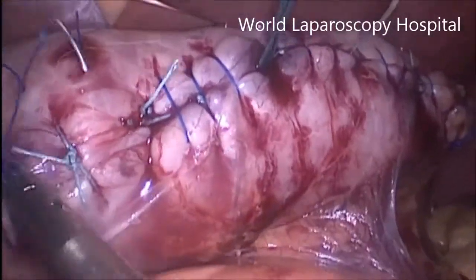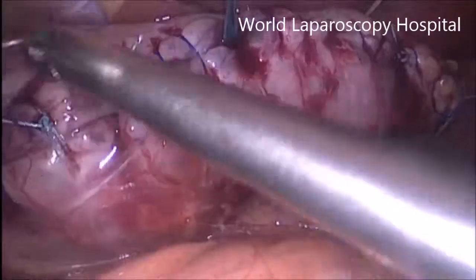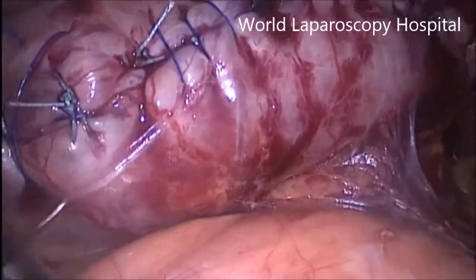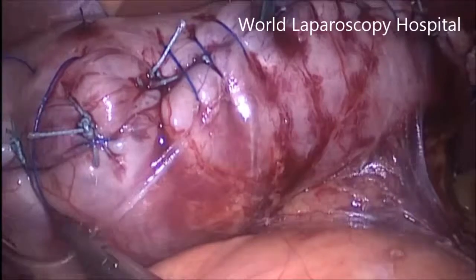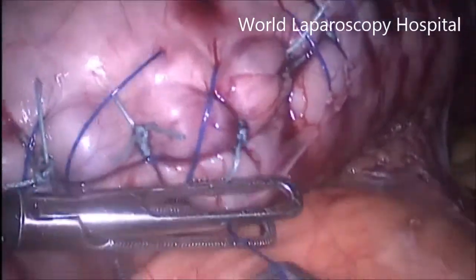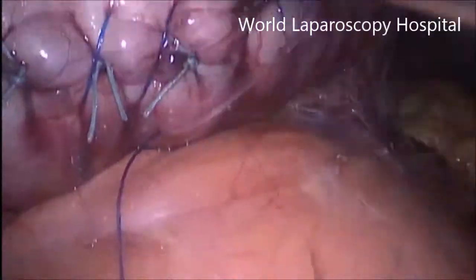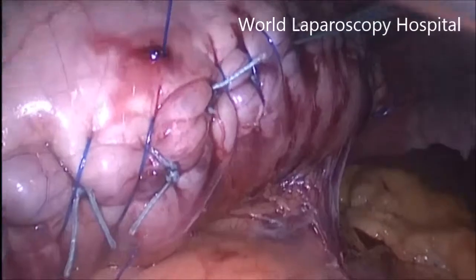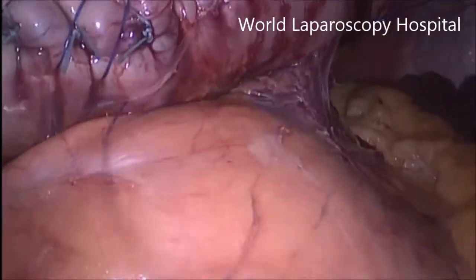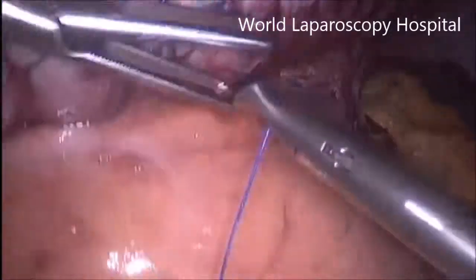At the end of the procedure, you have to make sure there is a 36 French orogastric tube towards the lesser curvature, and ideally that orogastric tube should come up to the duodenum and there should not be kinking in the stomach. So now this is the first suture and here this is the second suture, and both will be tied together.